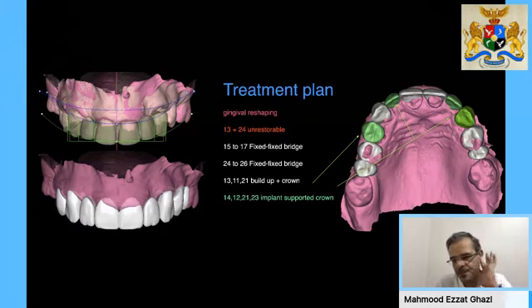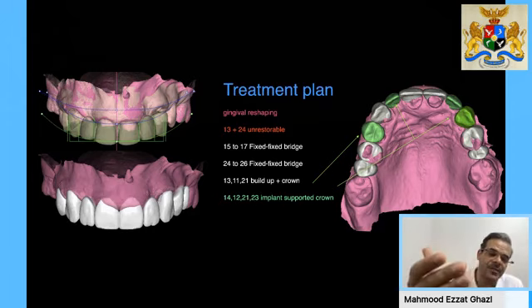After that, we started to treatment plan where the crowns are going to be, where our implants are going to be, what we need to reshape. And we started to decide that we needed gingival reshaping here at the centrals because I'm bringing the gingival levels to a higher level. So I'm going to need either gingivectomies or crown lengthening. I cannot decide right now because I do not have the CBCT in right now.